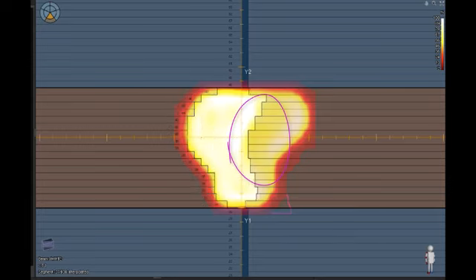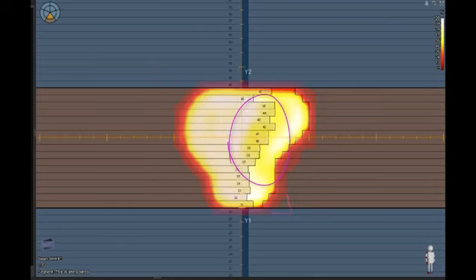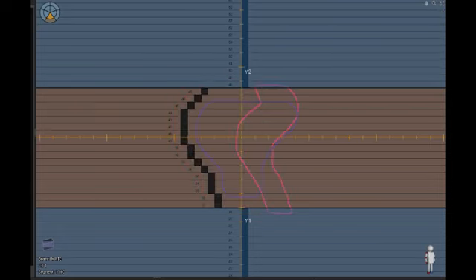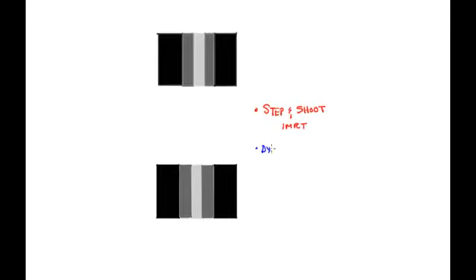You'll see it kind of preferentially covers that region. Leaves move out, and then they move pretty quickly over that region. So that gives you that lower dose in that region. Some regions are higher dose. So depending on the speed of the leaves in each region, you can provide intensity modulation as needed. So this particular method of IMRT is called dynamic MLC, DMLC, IMRT, and I think you can see where it gets its name.